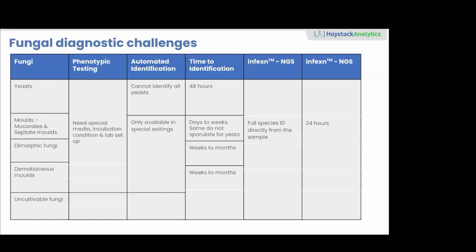So in a traditional setup, where a sputum culture or a BAL culture is put on blood agar, chocolate agar, and MacConkey, we streak and we wait. We need special incubation conditions. Even if we streak it on SDA, it would still take me 48 hours to tell the clinician that a mold is growing, or to do a critical reporting to the doctor. So the clinician has to, by and large, cover with a broad spectrum antifungal for that emergency report that I give him.